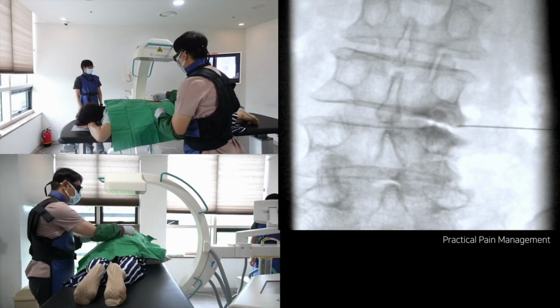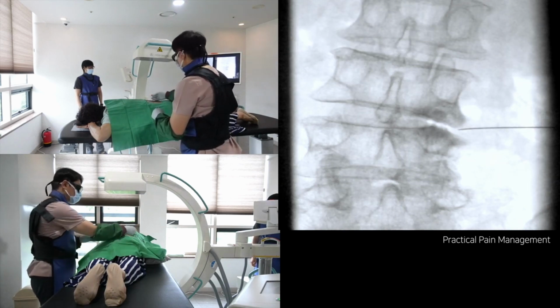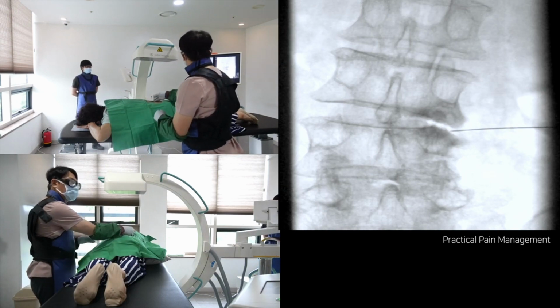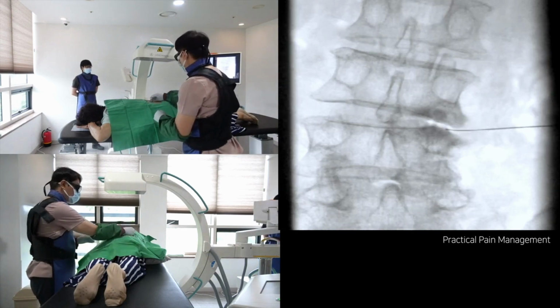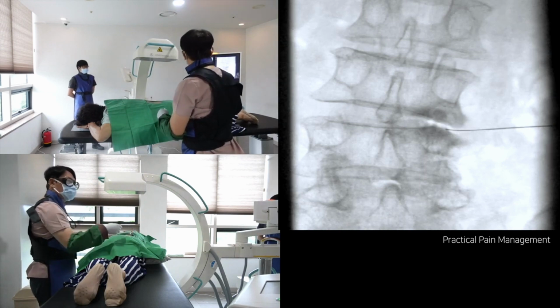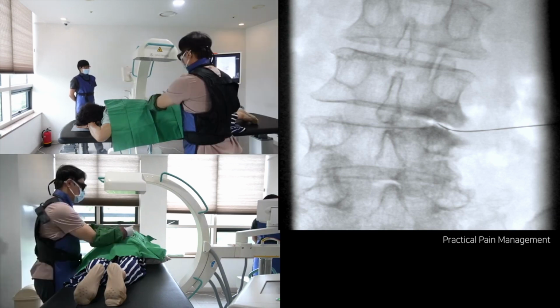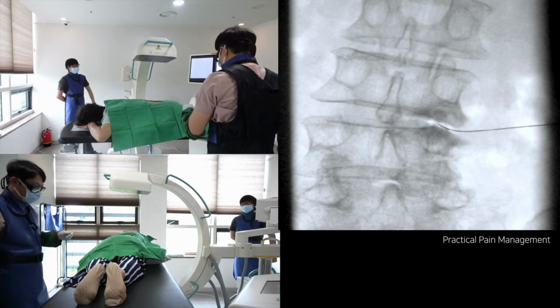In the past, I confirmed the intradiscal space with contrast media. However, to prevent an increase in intradiscal pressure, I now only inject a minimal volume of medicine. This is because an intradiscal injection risks pushing the internal content to extrude through an annular defect, and even a small volume of contrast can add to the rise of intradiscal pressure.